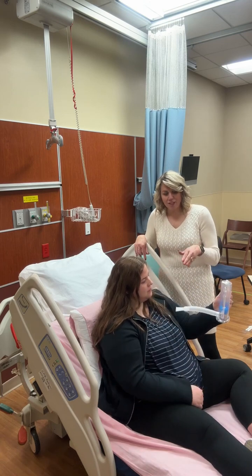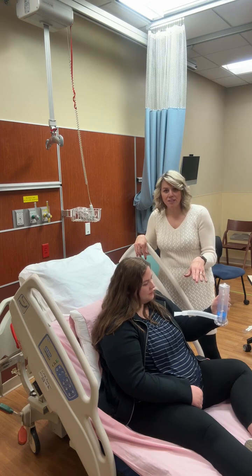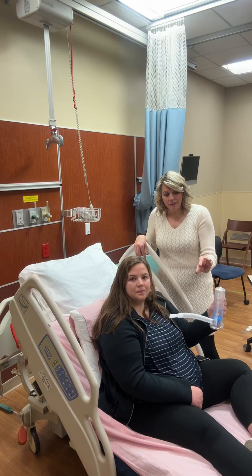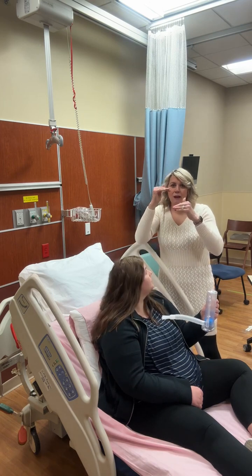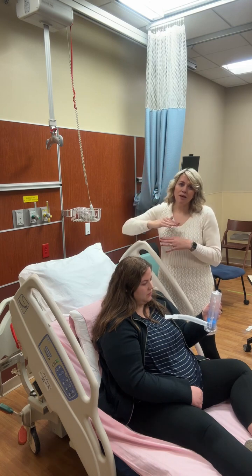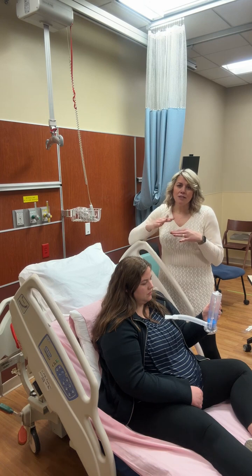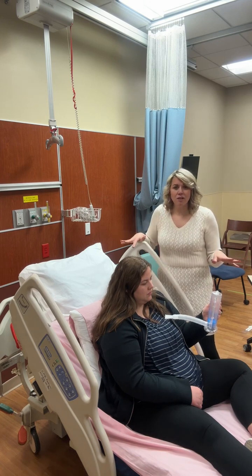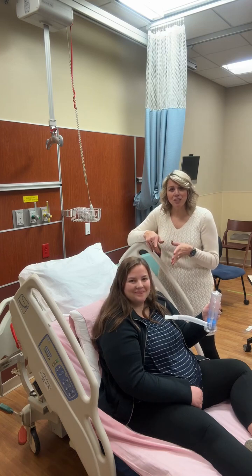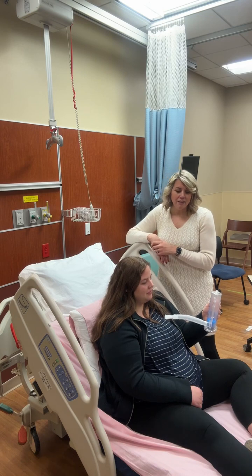Perfect. And she actually did improve the second time compared to the first time when she did it the right way. And so when you're listening to that noise on there, you can hear that toggle. It's just sort of hanging there. That's when you know your patient is doing it right. When it hits the top really hard, it's probably going to hurt, and they're not going to want to do it anymore. So if you just lay out the instructions right away, it will really help you have a better relationship with the patient, and they'll trust that you know what you're doing with this incentive spirometer, and that you're trying to help them.